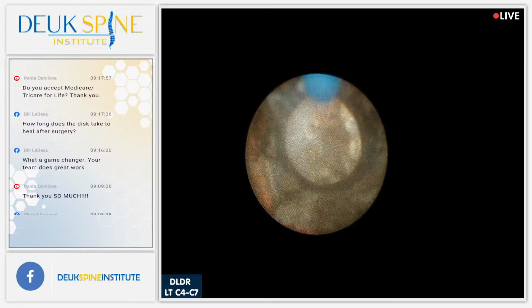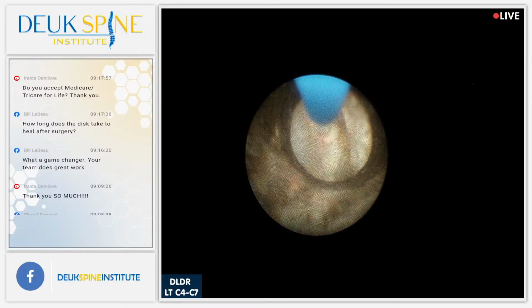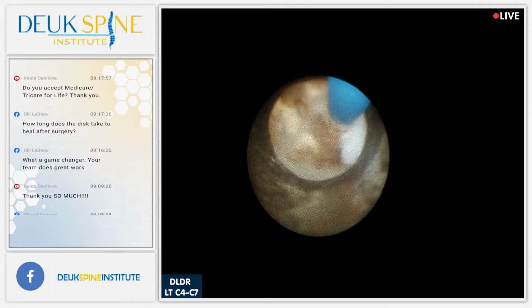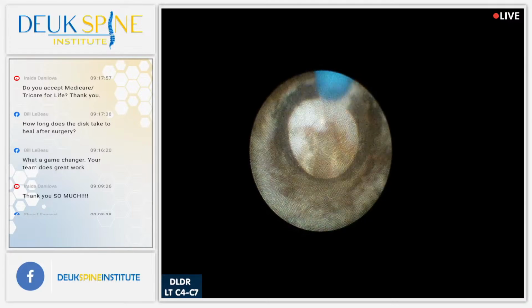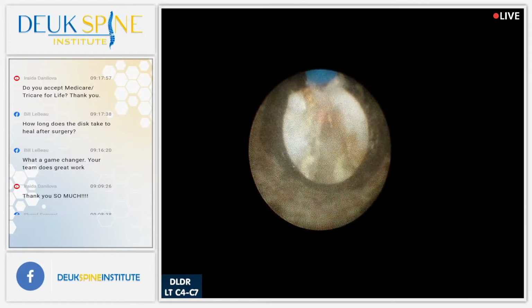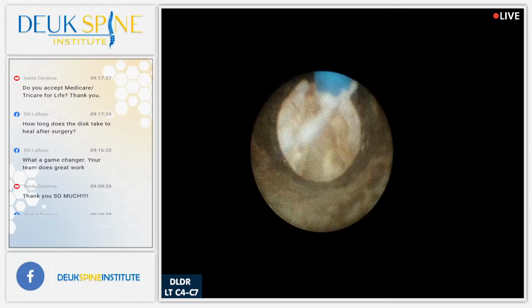All right, so this is 5-6, and you can see the laser. It's covered in blue plastic until you get to the end where there's a little glass fiber poking out. And really, the laser fiber is a glass fiber. It's a standard optical relay fiber that's used.